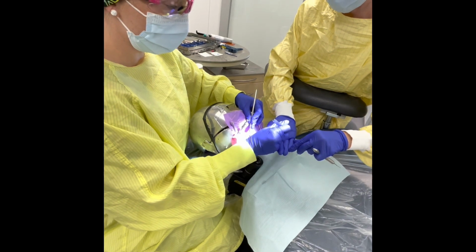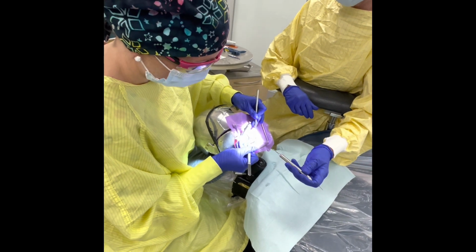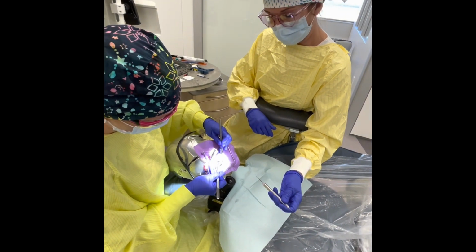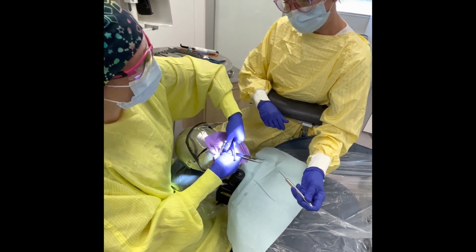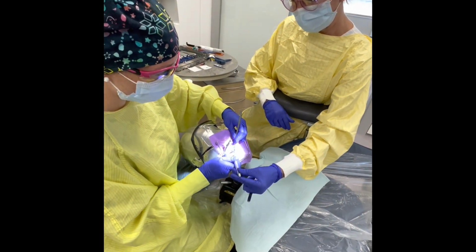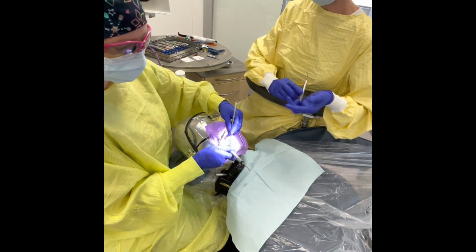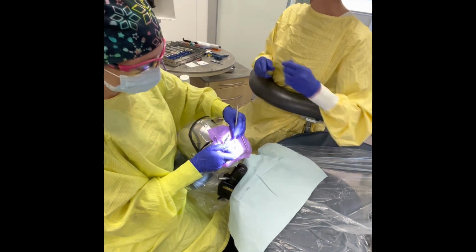I'll take my cotton plier and my wedge. Properly here. Then I will pass Stacy the cotton plier. She will pass me the Explorer next, followed by the burnisher. The burnisher. Notice how Stacy's not shorting me any instruments. Everything has been passed exactly where it needs to be. Thank you. Okay. All right.